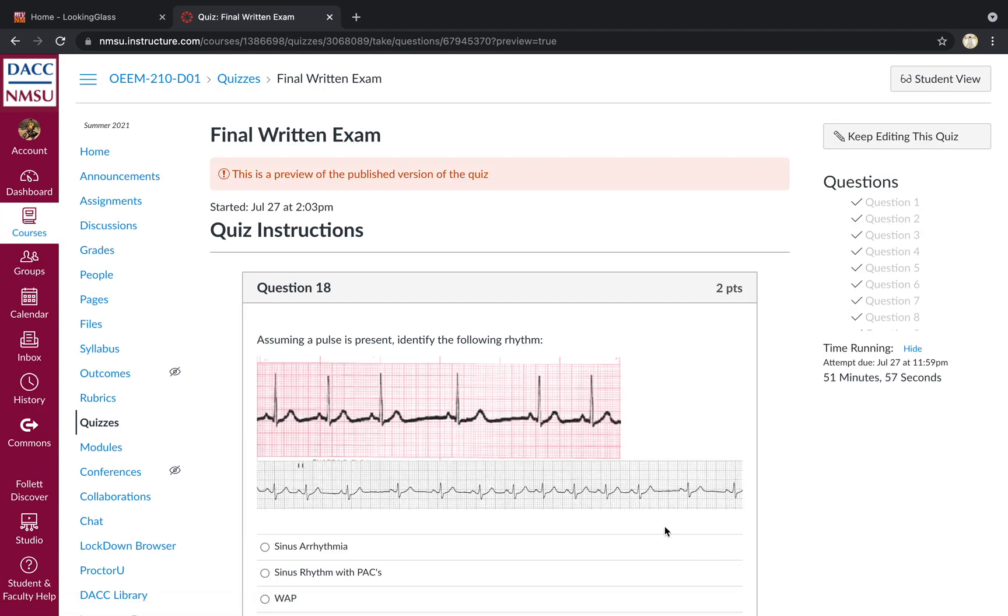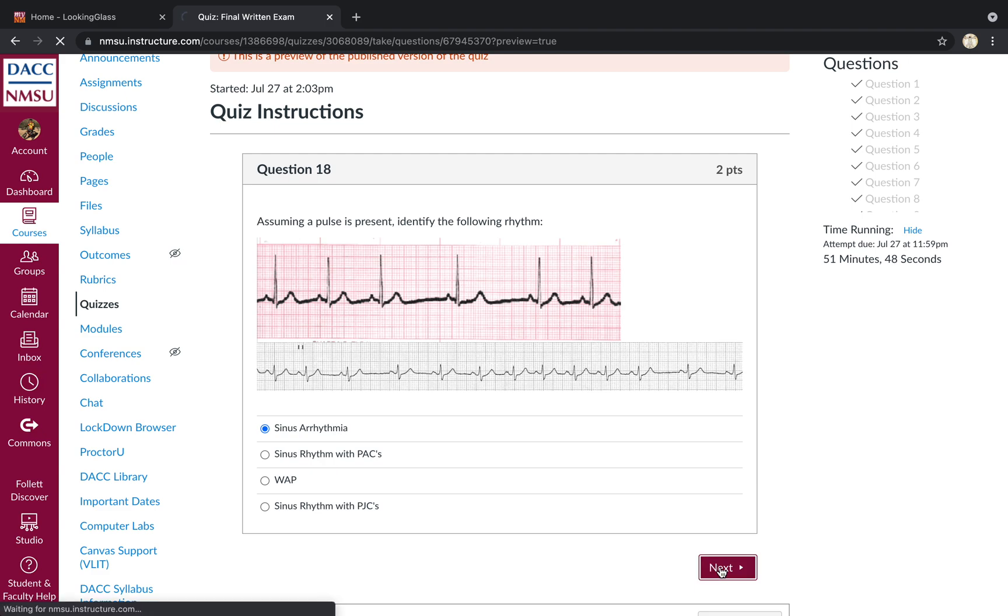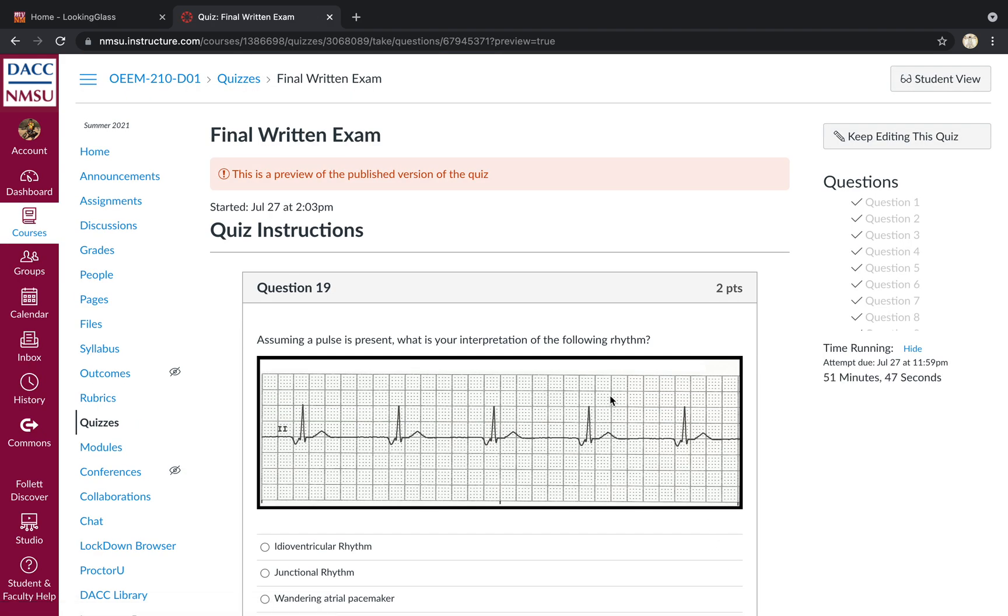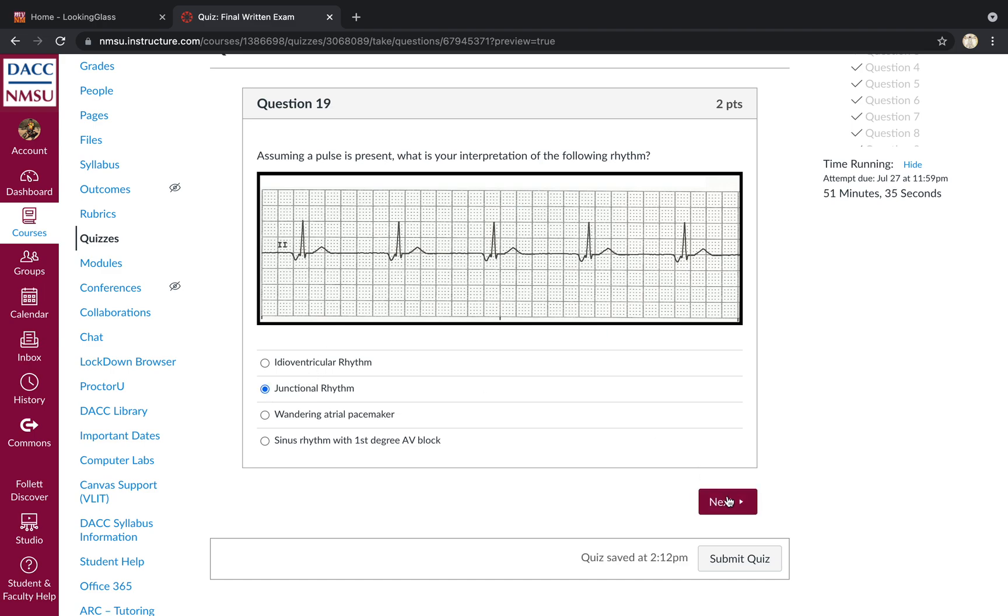Moving right along. Assuming a pulse is present, identify the following rhythm. That is classic sinus arrhythmia. Increase and decrease in rate. Question 19. Assuming a pulse is present. What's our interpretation? So you've got inverted P waves that are very close to the QRS complex in a slow rhythm. And these are classic findings associated with the junctional escape rhythm.